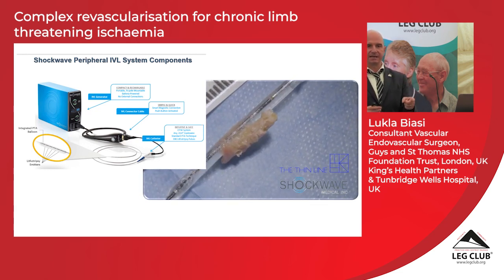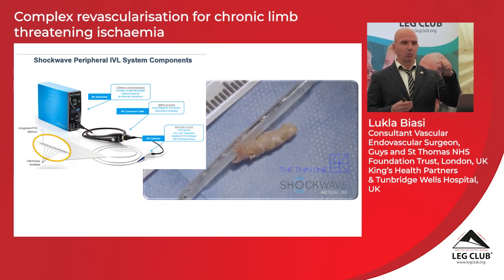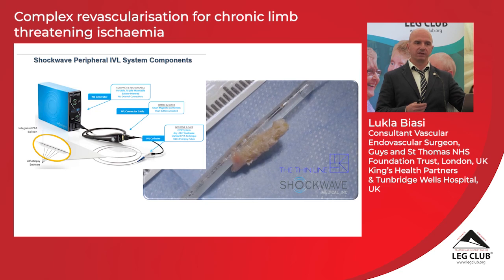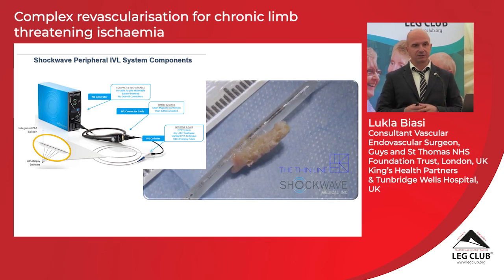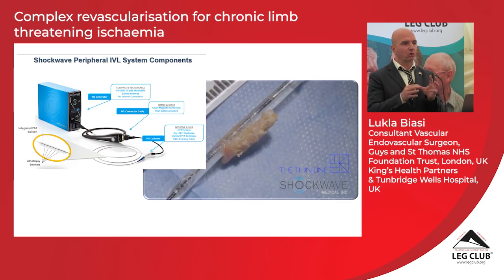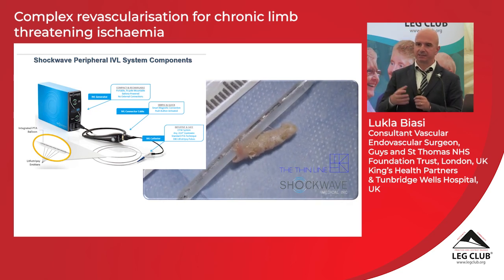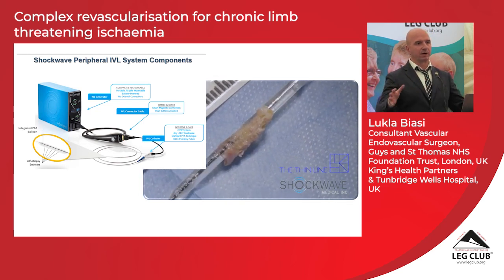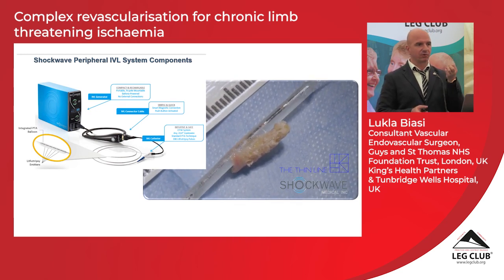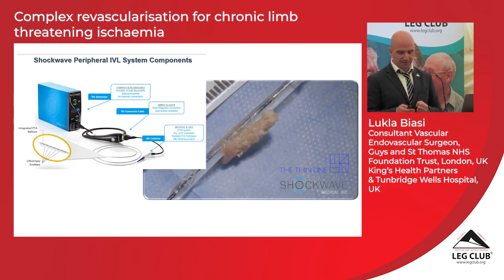Okay, the ability of the clinicians, the healthcare professionals, is to identify what technology works better for that specific case at that specific time. So the ultrasound intravascular lithotripsy is indicated for patients that have a very calcified blocked artery, but with no fresh atheroma, no fresh clot. Because otherwise, while you are breaking down the calcium, the fresh clot would go everywhere, and it could be a disaster. On the contrary, the atherectomy device with the drilling and aspiration is very good for those patients that have relatively fresh clot that can be sucked through.